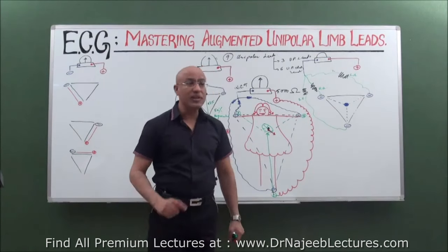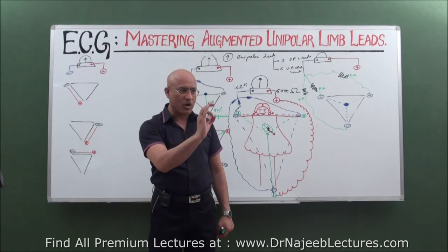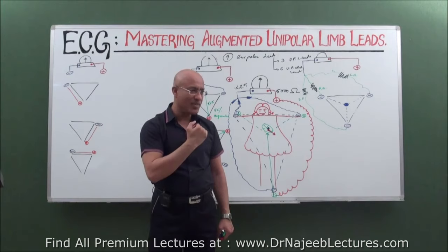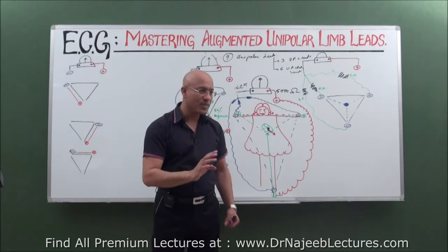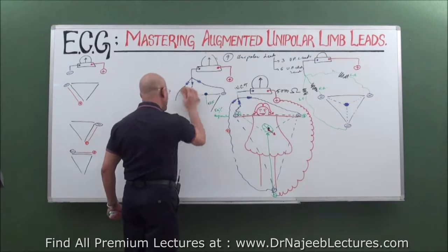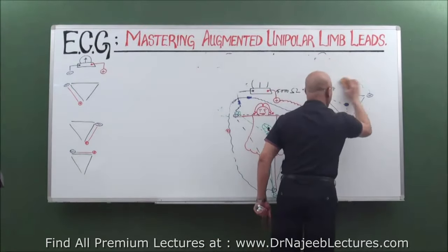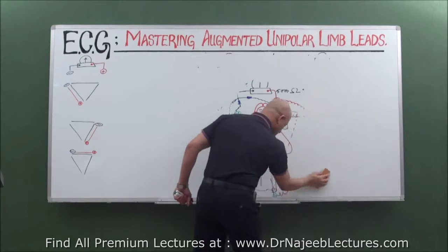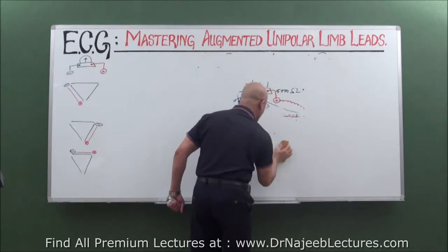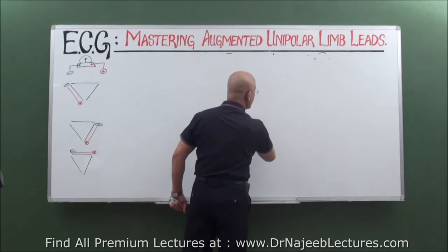Again, I will say the pattern will change, because when the positive electrode is put at different positions, the view of the electrical activity of the heart changes. Now we are going to see that. Okay, I will remove this also. Now we are going to talk about what the ECG patterns are which are drawn by unipolar augmented limb leads, AVF, AVL and AVR, and how they compare with bipolar limb leads. So let's make a comparison.